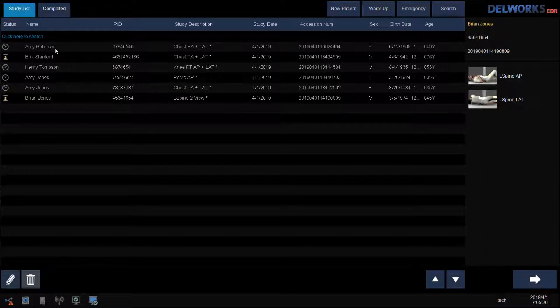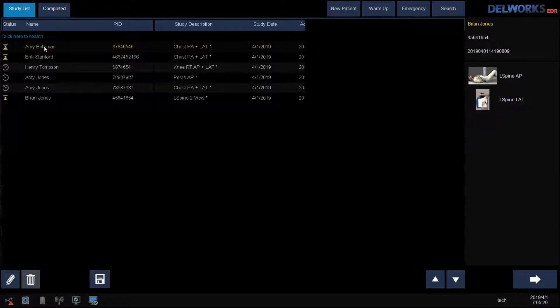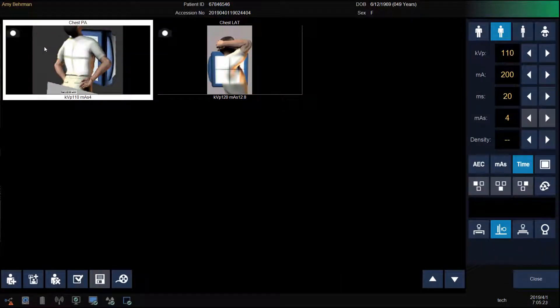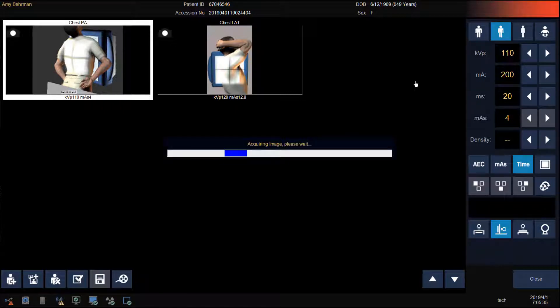Double-click on your patient's name. Select the view that you want to start with first. Verify the workstation and adjust technique based on patient size. Position your patient and make your exposure.